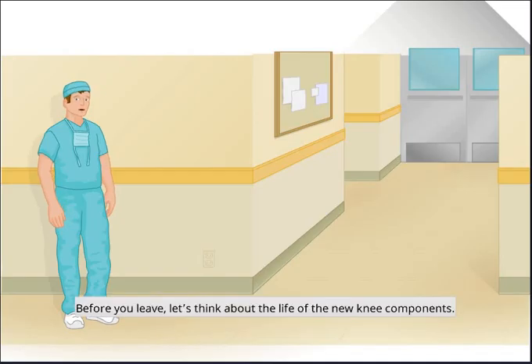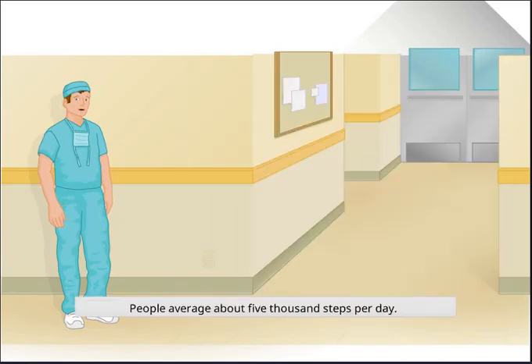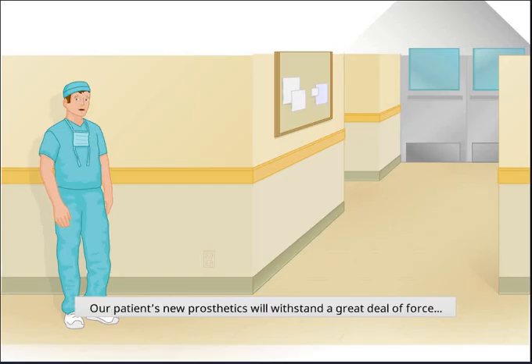Before you leave, let's think about the life of the new knee components. What kind of forces do you think the new knee will need to withstand? Nice job! People average about 5,000 steps per day. Our patient's new prosthetics will withstand a great deal of force for 36 million steps or more.